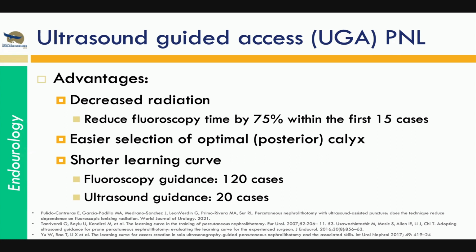And because this learning curve is a little bit shorter, in another study, they looked at the fluoroscopy time, and within the first 15 cases, they report you can reduce your fluoroscopy time by 75%, which is obviously quite significant for the operators, all the staff in the room, as well as the patient themselves.